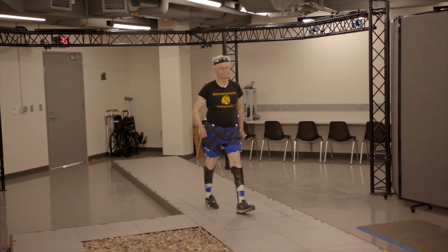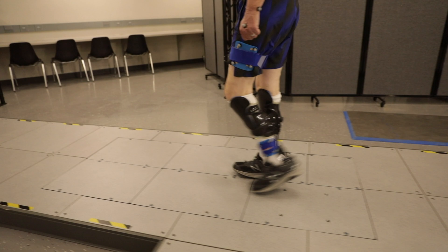What we're able to do with that model is essentially integrate the movement data with the force data to calculate how much energy is being stored by the devices and also how his limb is functioning as he walks.